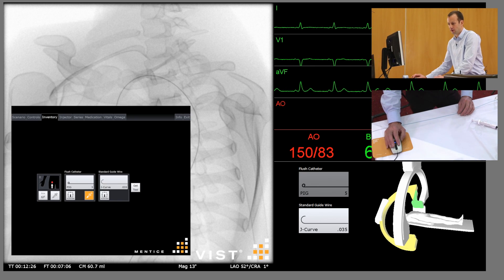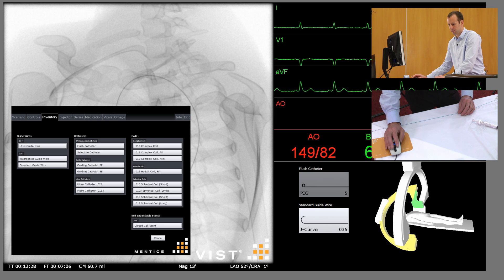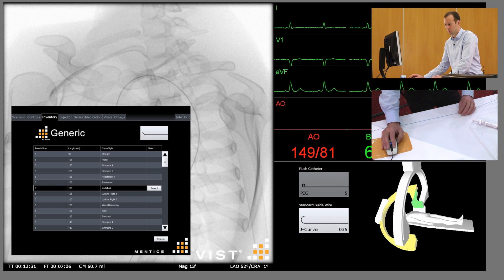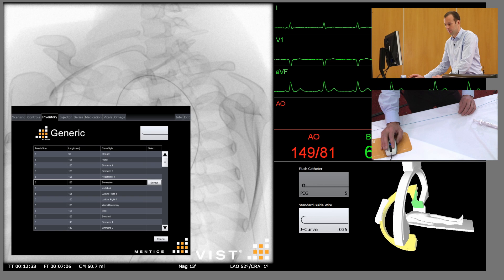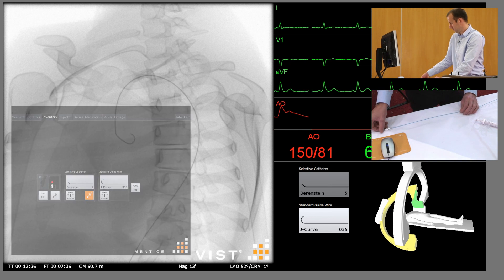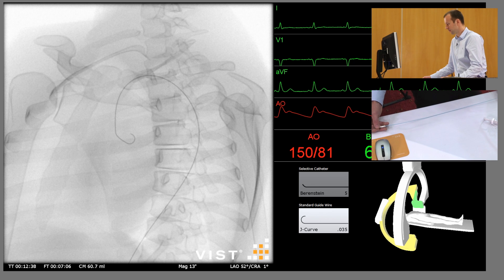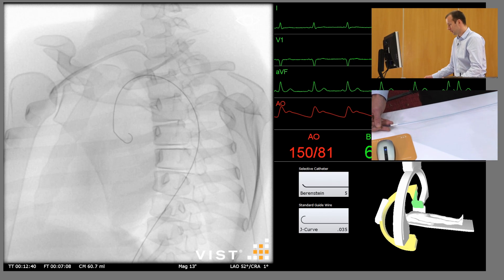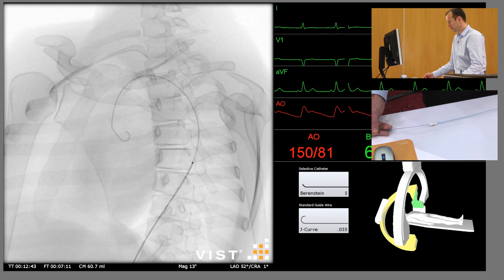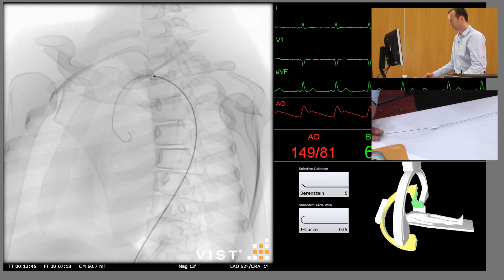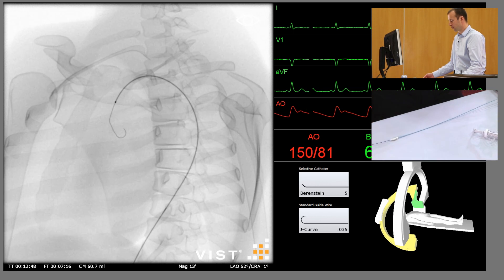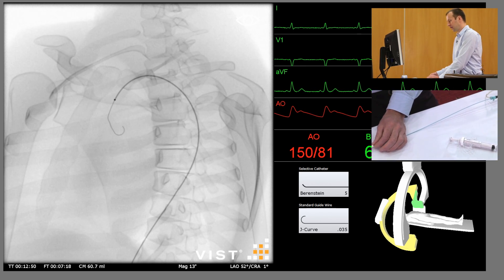We're then going to change to a selective catheter. In this case we're going to use a Berenstein catheter, 5 French, and reinsert this over the guide wire, past the target vessel. We're going to engage it by withdrawing the catheter rather than advancing it into it.